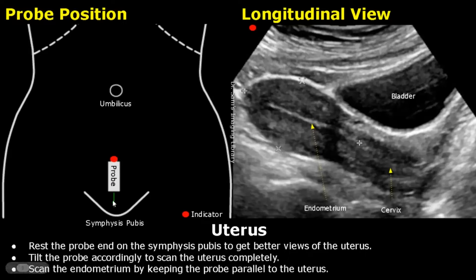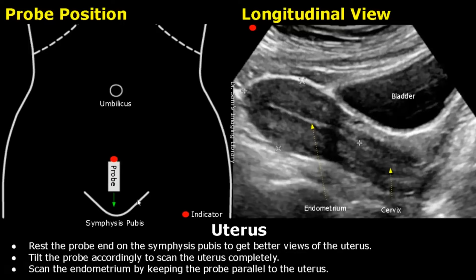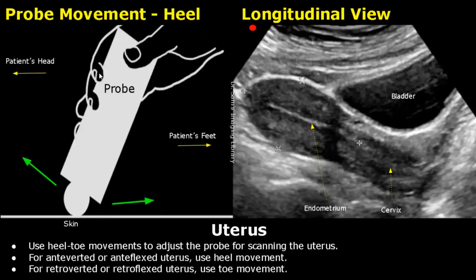You can also rest one end of the probe on the symphysis pubis to get better views of the uterus. Tilt the probe accordingly to scan the uterus completely. For scanning and measuring the endometrium, try to keep the probe parallel to the uterus.